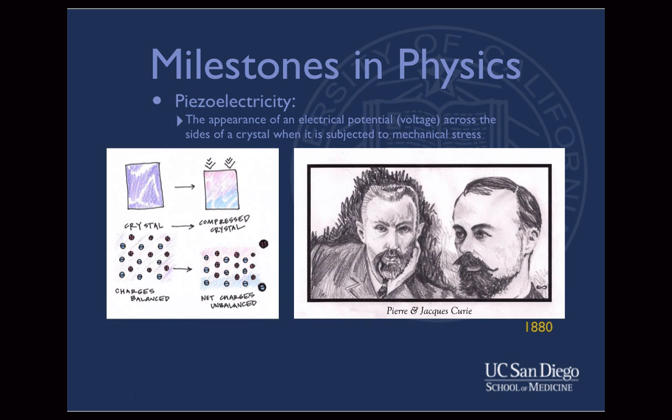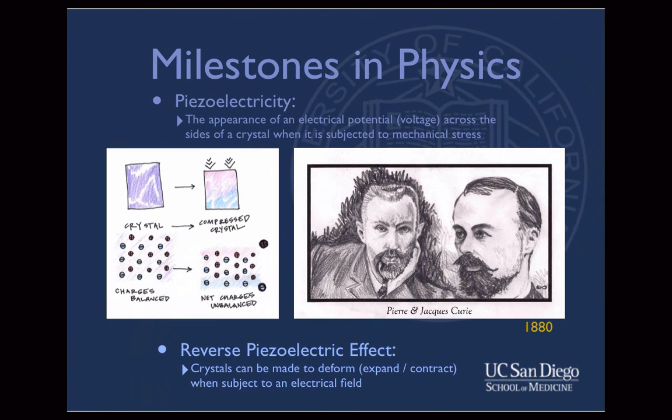One year after describing this effect, the Curie brothers also confirmed the reverse piezoelectric effect, which states that crystals could be made to deform when subject to an electric field. Overall, this was a revolutionary finding which was the basis for the creation of modern ultrasound transducers, which contain piezoelectric crystals within.